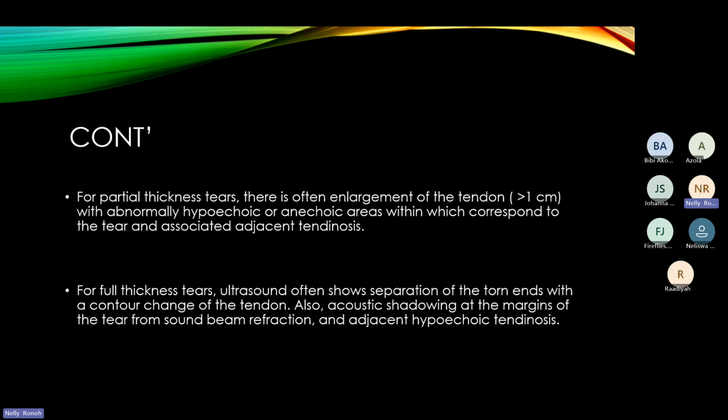corresponding part, or where there is a tear, you could associate it with tendinosis. And I want to explain the difference between tendinitis and tendinosis. So in tendinitis, in most cases, the tendon would be thickened as opposed to really being heterogeneous. I believe you had learned earlier about the terminologies that we use in ultrasound. When we talk about hyperechoic, hypoechoic, isoechoic, could someone just confirm to me if you've heard that lecture before?